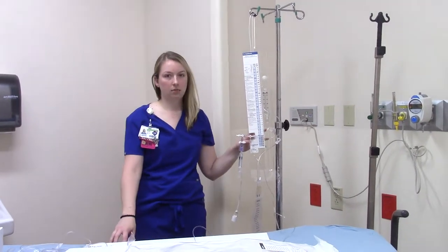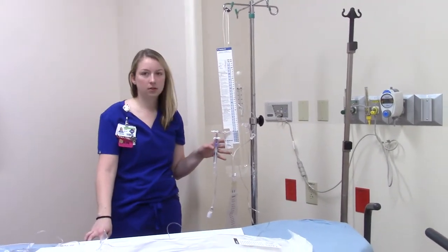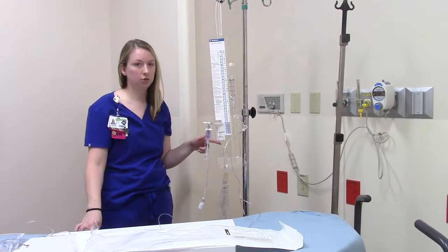Now that we've talked about how to set this up, there are a couple of things you need to know to finalize the setup, which will be zeroing and then what you need to do for transport.